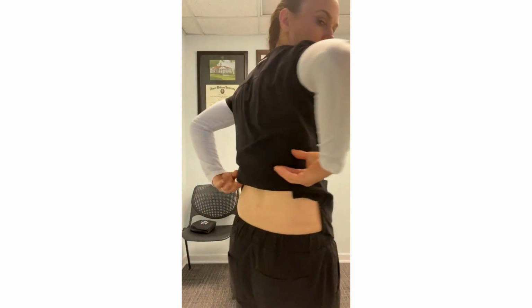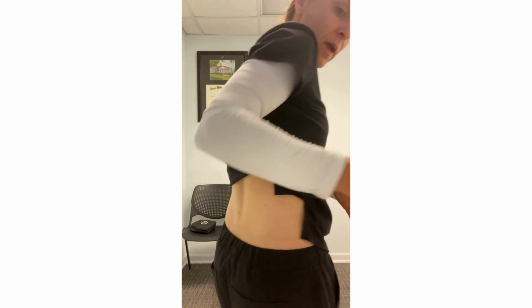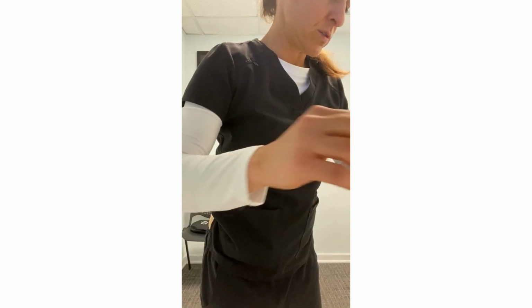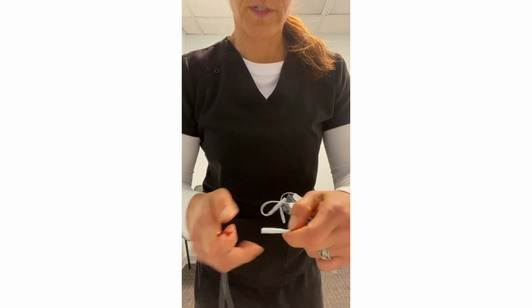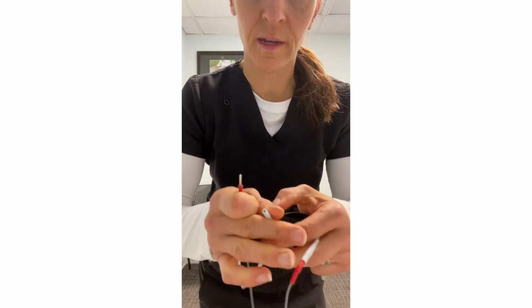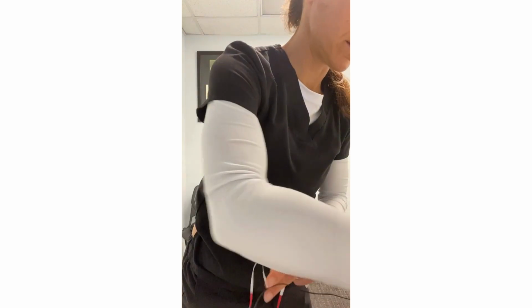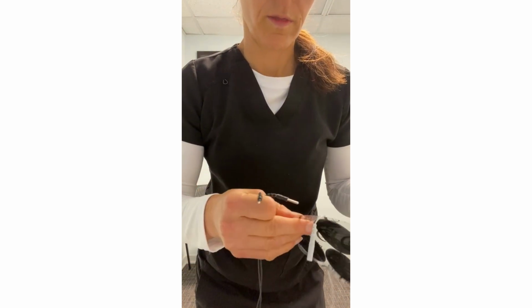So I've gone ahead and I've just tucked my shirt up so you can see. I usually, let me come around here, set the leads up first. So I'm going to take the red leads first, and we'll go ahead and just connect them, and you want to make sure it's a good snug connection, right? And then we've got the black leads, and we'll go ahead and put the black leads on.